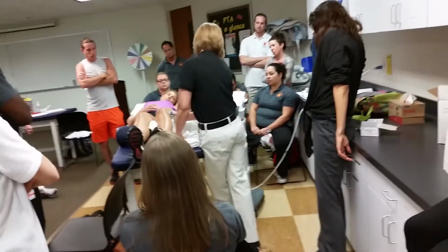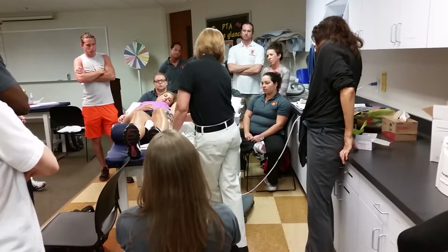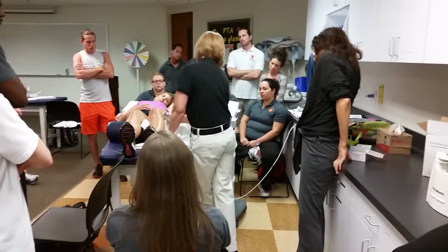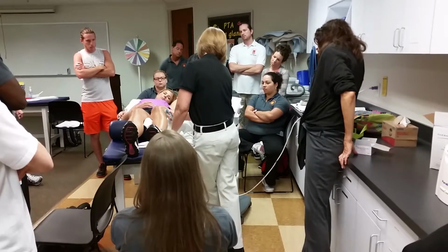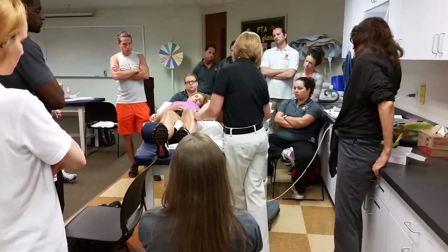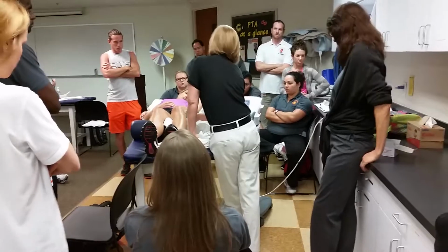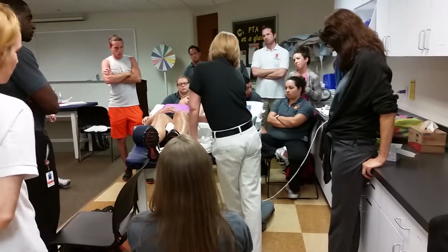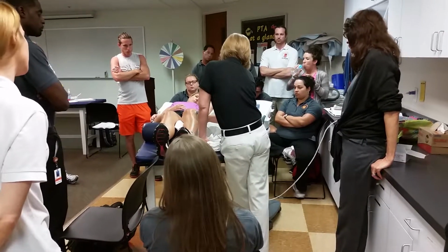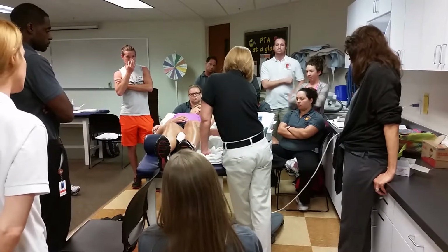So again, my treatment area is generally 2 times the size of the sound head, and it's 5 to 10 minutes per treatment area. Okay. Now, it used to be that depending on how fast you move the sound head, and it still really applies, if you're moving it, it's not going to build up heat as much. So in general, you want to move it kind of slow, so you're giving the tissues a chance to build up.